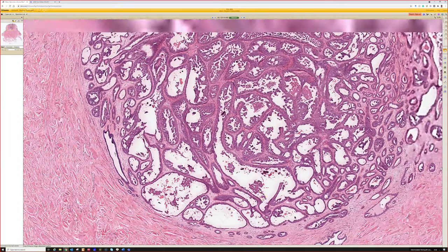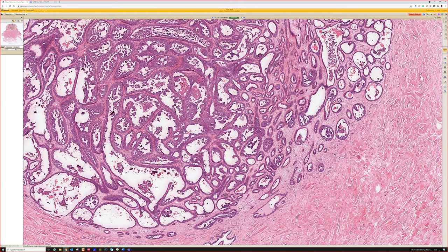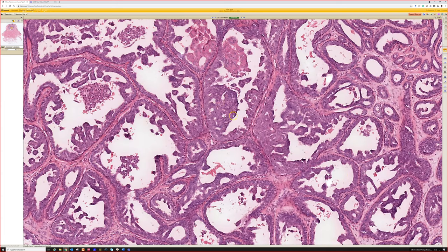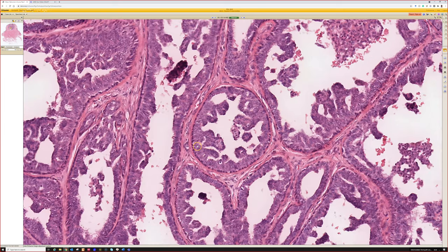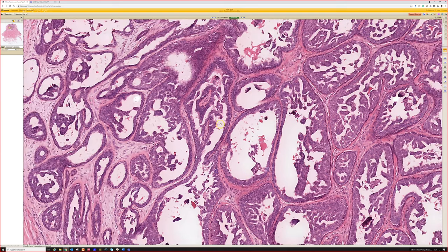And finally, here's the tumor, and it's made of multiple ducts and tubules packed closely together, many of which have complex papillary structures that grow into the lumen and then fuse together. And so it makes these almost very interconnected anastomotic papillary structures in the lumen. And you can see a nice layer of myoepithelial or basal cells around the outside, and then the inner apical cells, which are larger and have larger nuclei. So you often see apocrine snout looking structures in here.